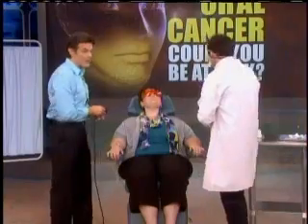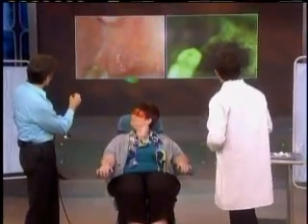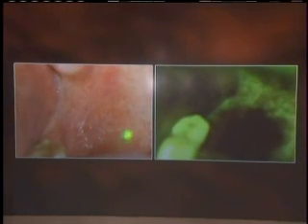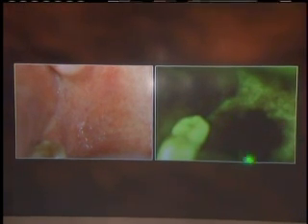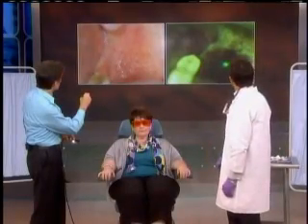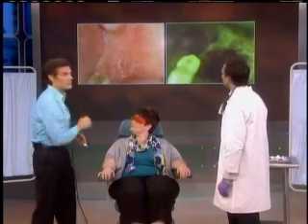Let me show you an example of what happens when they do change. Here's the picture that we would have gotten normally. This is a normal eye view. The tooth is here, and you don't see anything too abnormal. Well, notice this area looks a little bit indented. Look what happens in the Velscope. Instead of the normal green, you have that darkened area. So you all see that? Yeah. So it's very helpful to aid the eye in identifying that as not being normal.